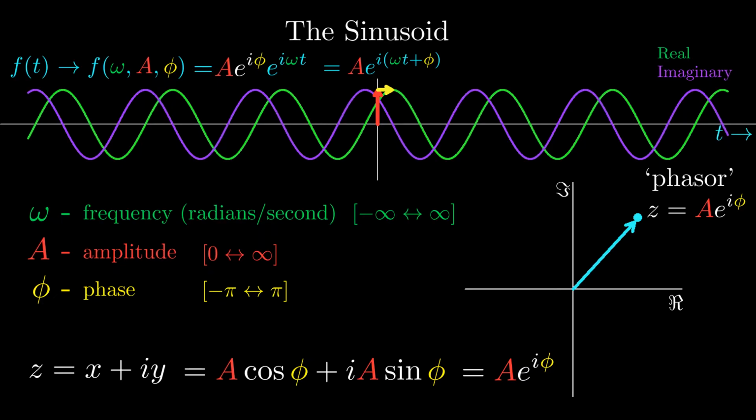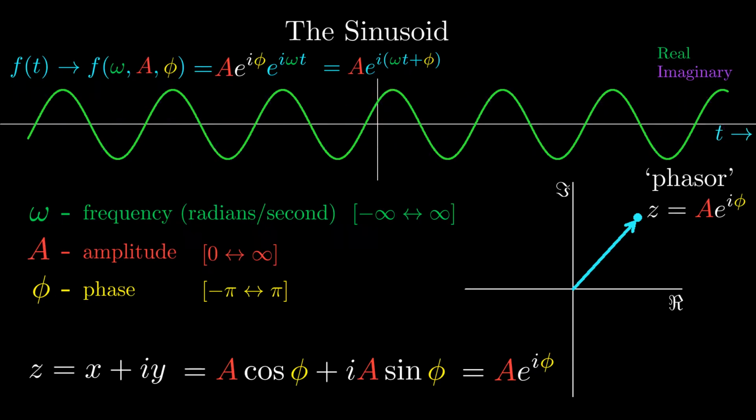And if you think plotting both a real and imaginary sinusoid is distracting or unnecessary, that's okay, you can just ignore one of them. It is actually common practice in many physics applications to do this, work the math with complex exponentials, then just ignore the imaginary part of the solution. To get us started, I'll also just display real functions.